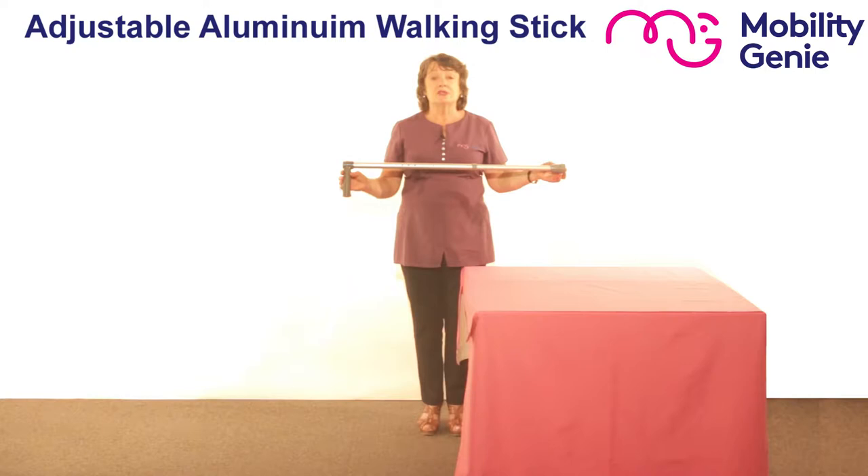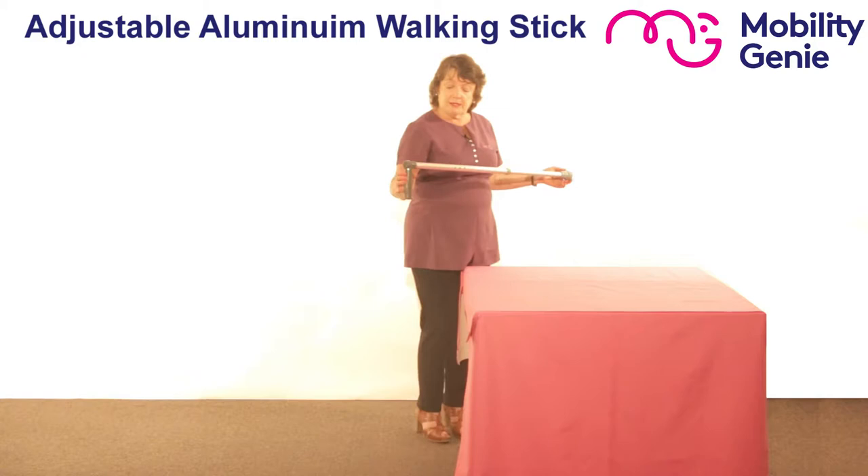Deirdre from Mobility Genie. At Mobility Genie, we recommend this adjustable lightweight aluminium walking stick.